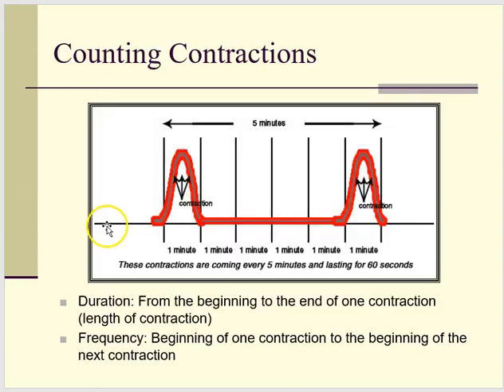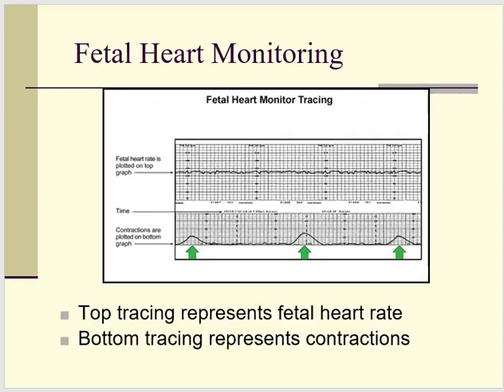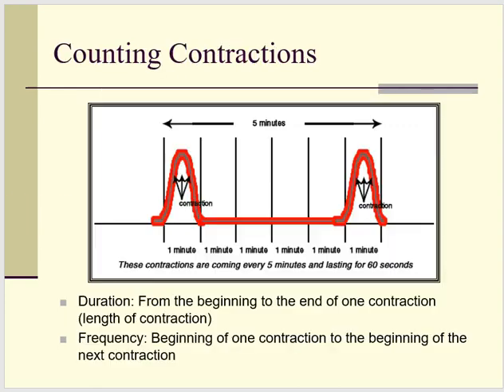When we're looking at the contractions, how do we count them? There's a lot of misinformation about this out in the community. When we teach patients to count contractions, what we want them to do is to time their contractions from the beginning of one to the beginning of the next. So I'm going to go back here momentarily. Here's the beginning of one to the beginning of the next. Here, beginning of one to the beginning of the next.